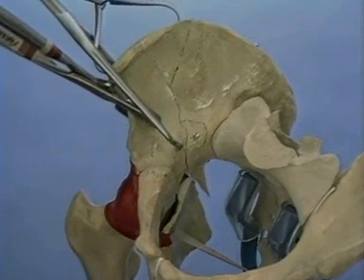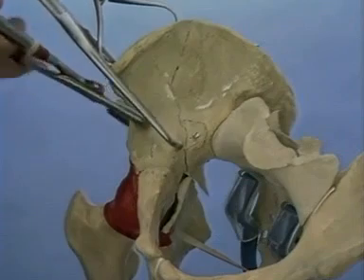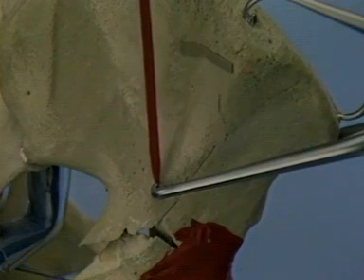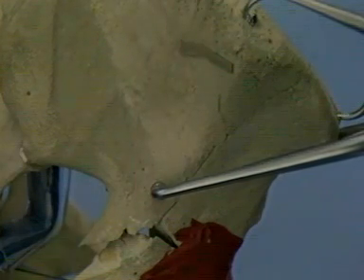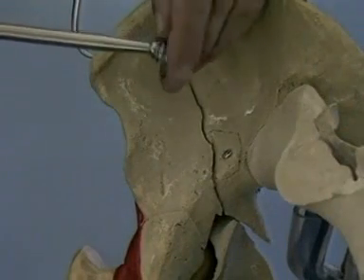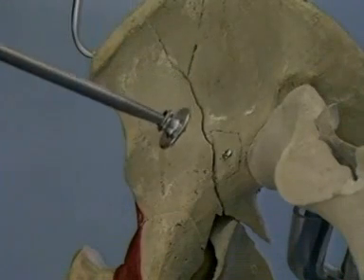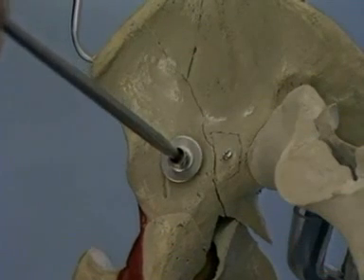Pointed reduction forceps are used along the iliac crest. The king tongue is seen on the outside of the bone with its tip on the intact ilium. The two points are positioned on different bone fragments because of the obliquity of the plane of the anterior column fracture. A spiked disc can be attached to the tip of the ball spike or other ball-tipped pelvic reduction instruments to prevent penetration in osteoporotic bone.